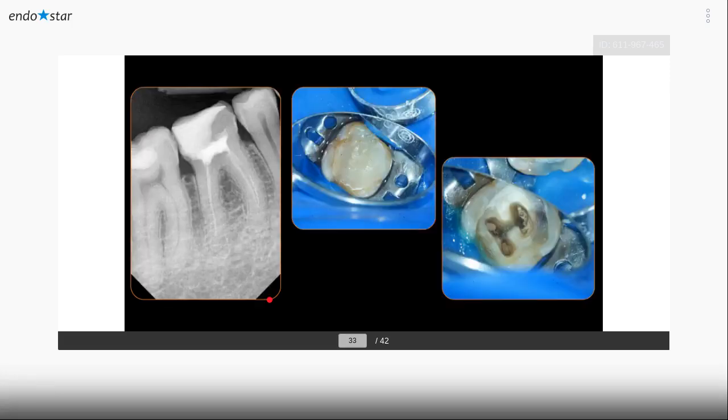One more case. Sometimes when we're working with retreatment, we can again see some old material. We remove the restoration, and we can see something is there, but it's not resorcinol. It's not so rigid, so you can start with Reendo files.